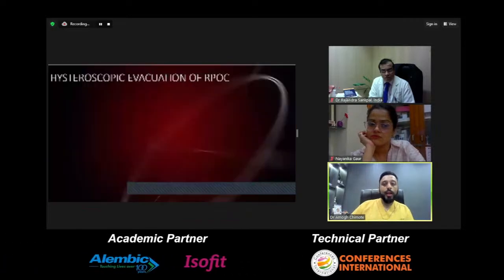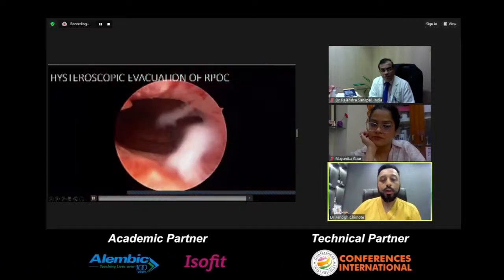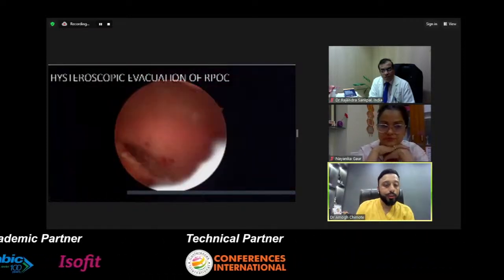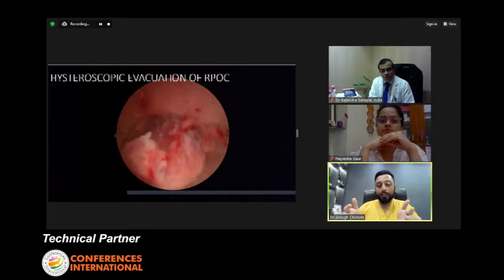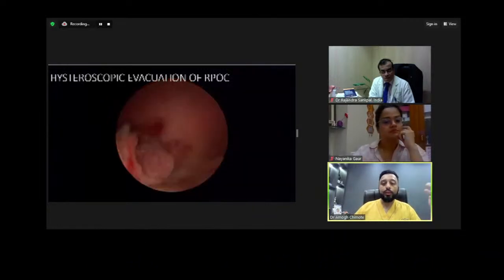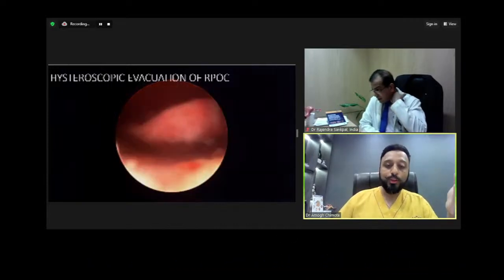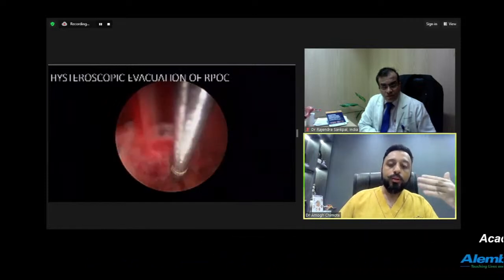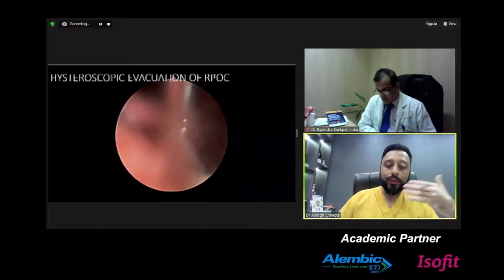Next, we have a hysteroscopic evacuation of RPOCs. Nowadays most of our colleagues are doing this. Here we can see a small segment of retained products of conception on the posterior aspect again. Many a times after medical termination of pregnancy or even after blind curettage, this is the kind of scenario that we can see. This patient was a post-surgical curettage patient who had come to my center with continuous spotting for the last 12 to 15 days. So we went in with the hysteroscope.